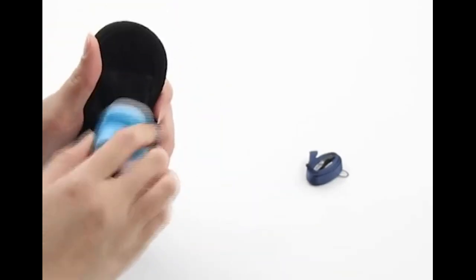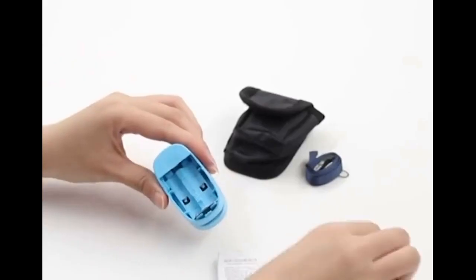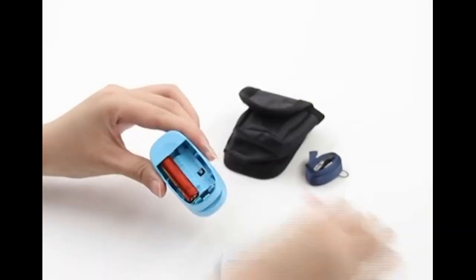Screen is easy to see and read. Please note that the Context Pulse Oximeter is intended for sports and aviation use only and is not a medical device. There is a very thin screen protective film which can be removed before use.